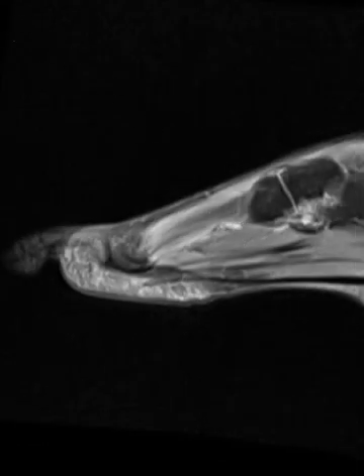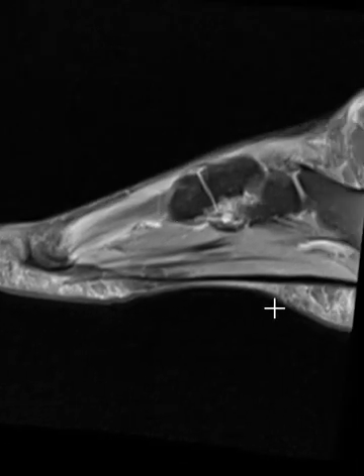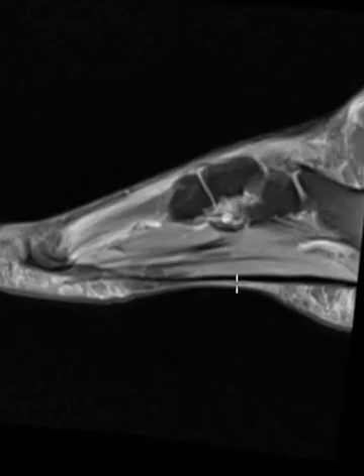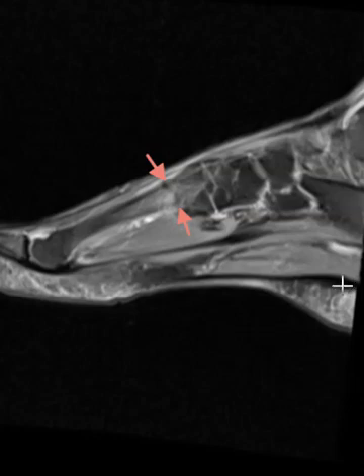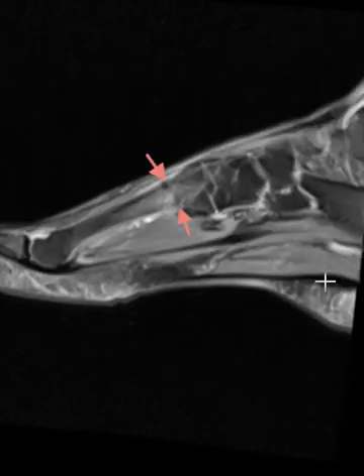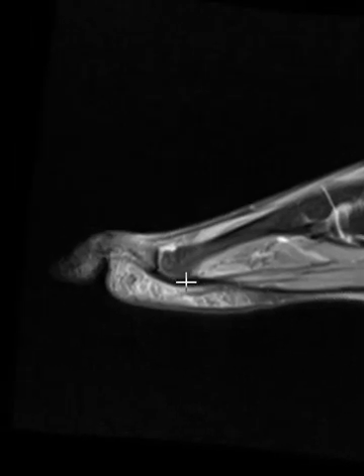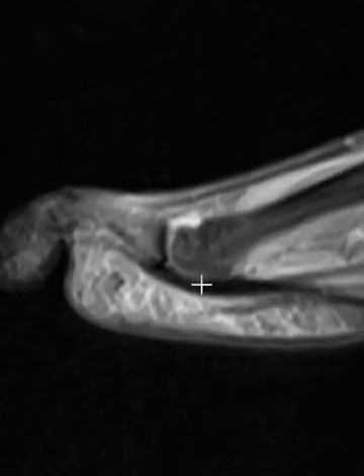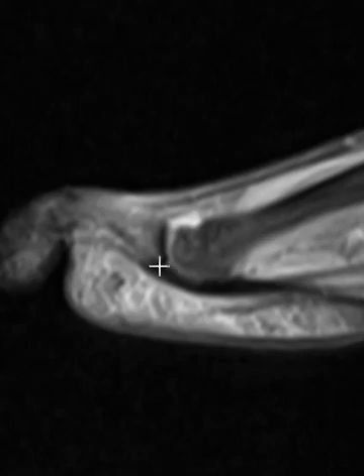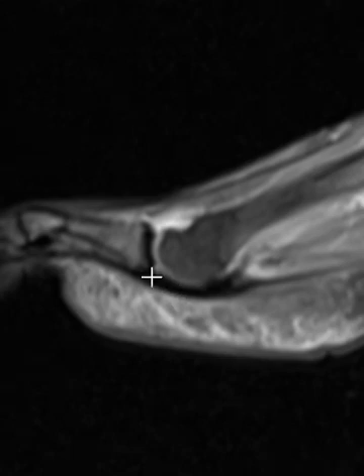In this view we can also see another finding we look for — this is the plantar fascia coming along the bottom of the foot; it looks normal. But patients can have inflammation in the plantar fascia — what we call plantar fasciitis. They can have little benign tumors called plantar fibromas. We can see the plantar fascia coming over here, and this dark band blends with the fascia, goes underneath the metatarsal head and attaches to the base of the toe. This is called the plantar plate. We look at the plantar plate to see if it's intact, and this plantar plate is intact.